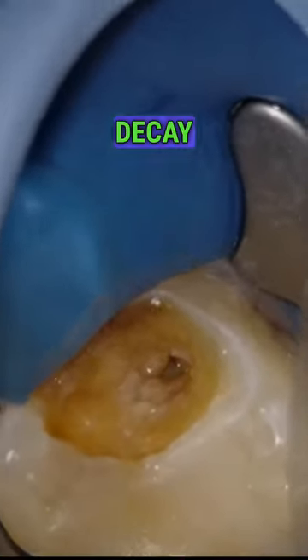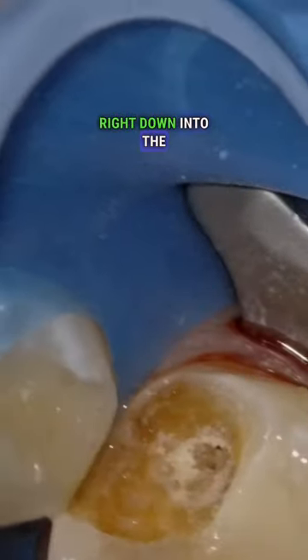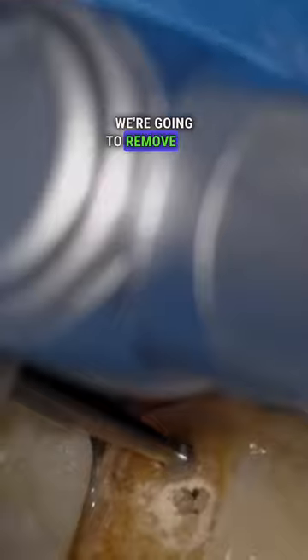Extensive caries in this case, decay right down into the pulp chamber. So of course we're going to remove all of the decay. It's never okay to leave decay — never. So I'm going to make sure it's thoroughly clean and debrided of decay.